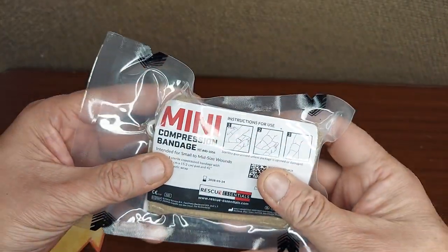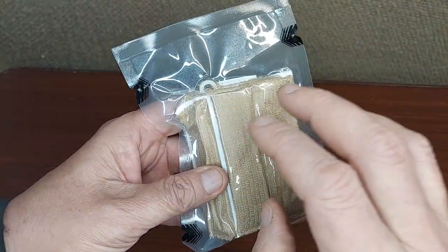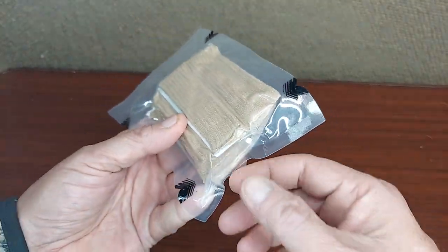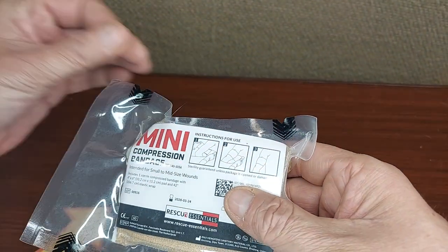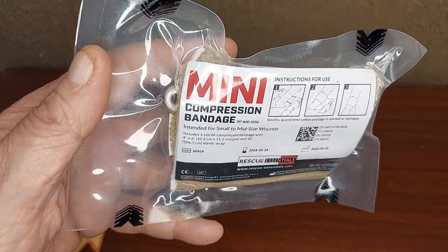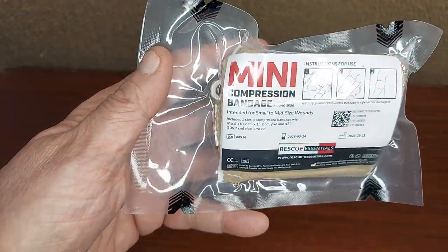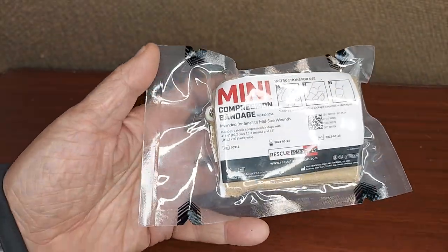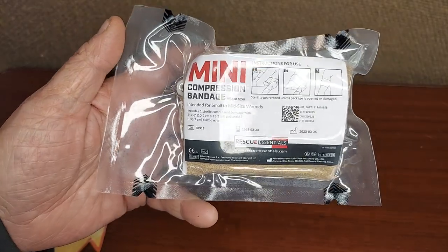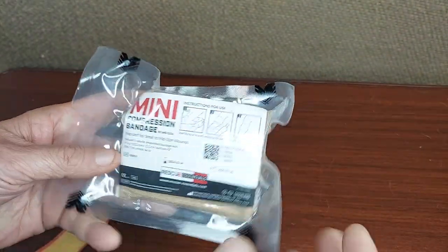These mini compression bandages from Rescue Essentials are vacuum sealed — the essential bandage for stopping a bleed. This is a very vital, important piece of kit in a rescue kit and a personal aid package. So next to a tourniquet, this is probably one of the most useful things to have, and this is a great package.